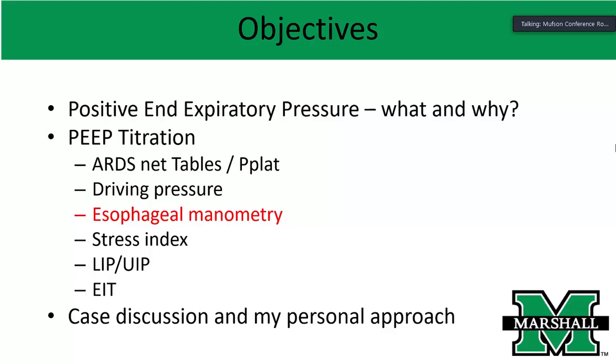You mean talk about 40 PEEP for 40 seconds? Yeah. So we're not talking about recruitment maneuvers, no. But recruitment maneuvers vary. There are studies on them. The vents we had bought and may start using soon have a built-in one that you control. You say, I want to increase the PEEP for this amount of seconds. But I'm not talking about recruitment maneuvers and studies of recruitment maneuvers in this talk.